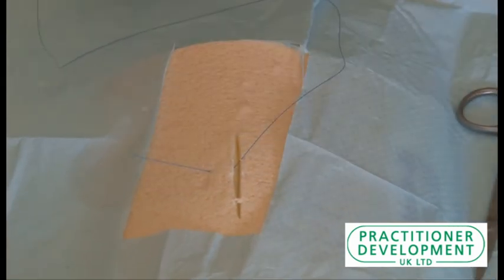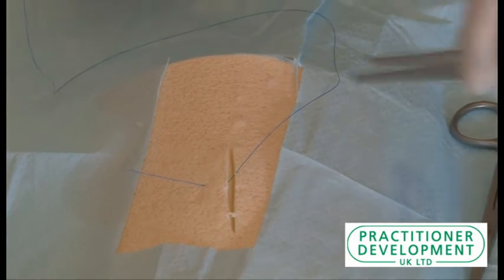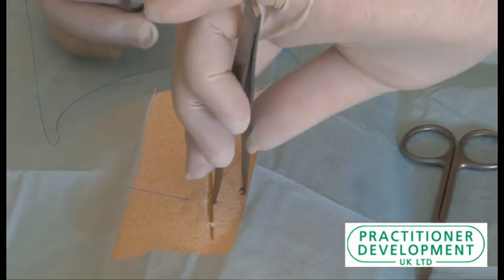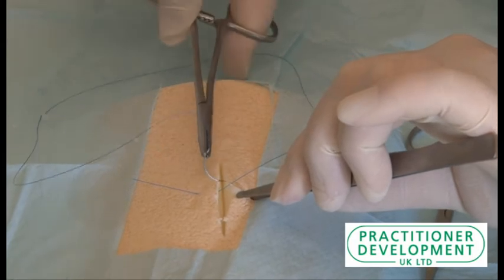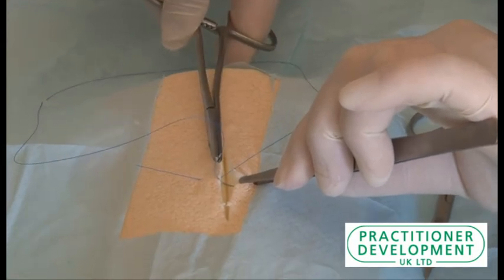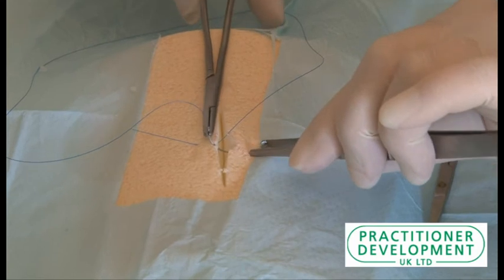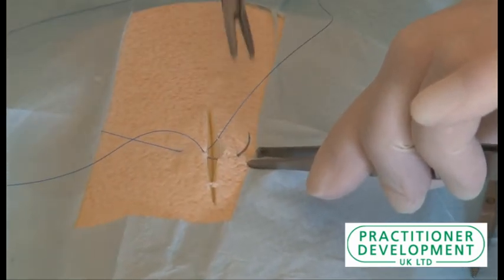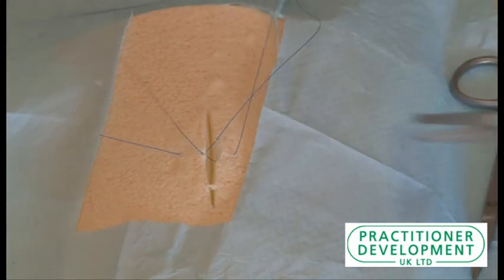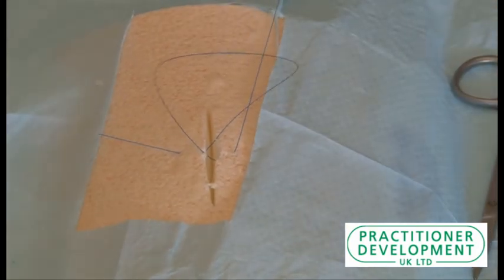I'm going to bring that through so we don't have so much thread on this side, and again I'm going to use the toothed forceps so you can see exactly where you're going in. This way you can see the base of the wound, and again we're going at 45 degrees, but this time we're going into the wound. Again, let the natural curve of the needle bring us out the other side. I'm going to bring this through.